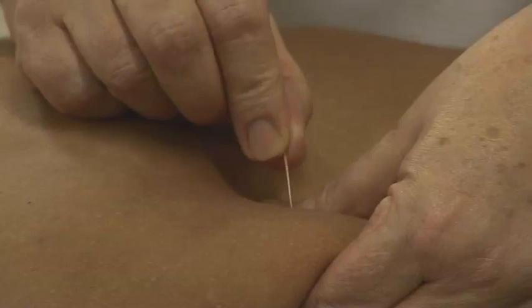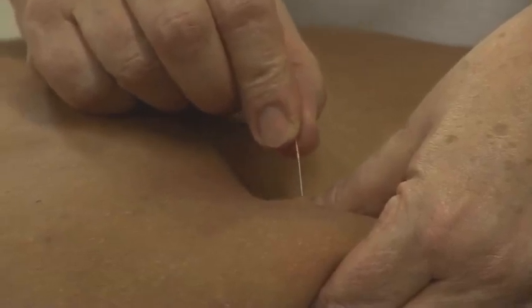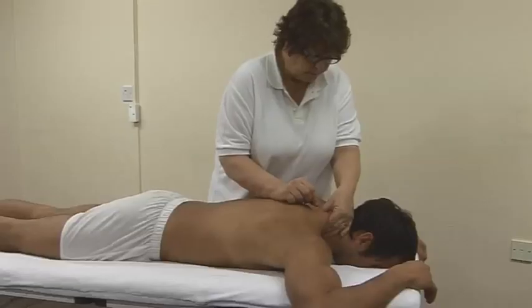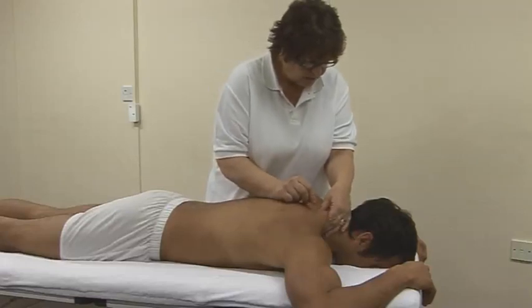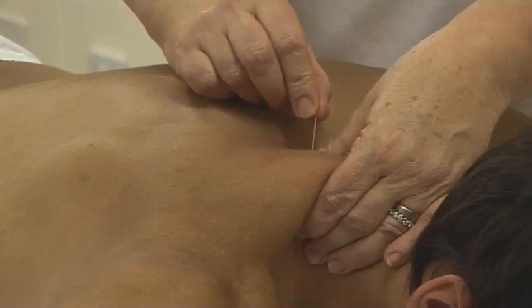You are trying to elicit the patient's pain referral pattern, so keep asking for feedback. The needling technique should be piston-like, and the angle may need to be changed in order to access and deactivate the whole trigger point.